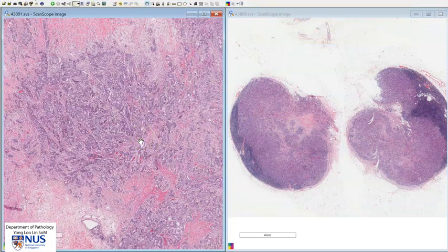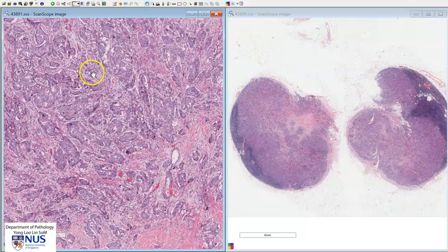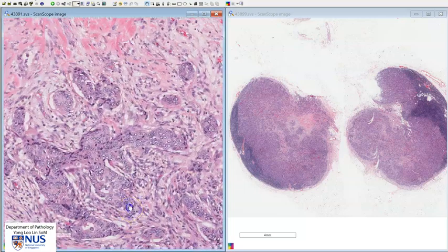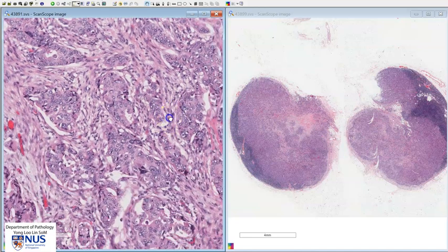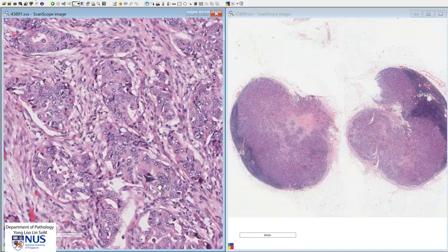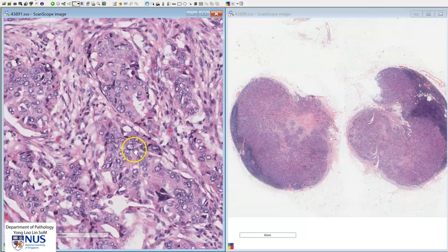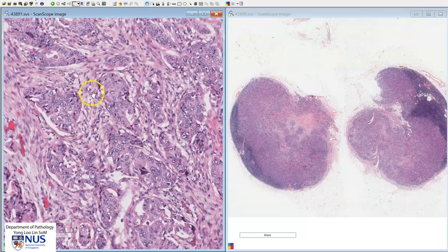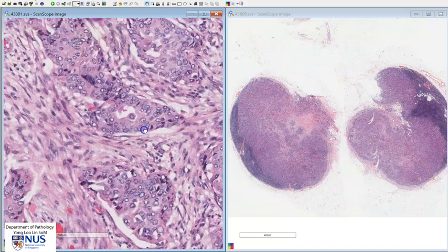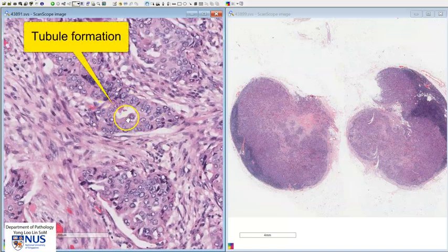Let's compare the primary and the metastatic tumors. In the primary tumor, we can see that the tumor is composed predominantly of solid rounded to irregular nests of malignant cells with a moderate degree of nuclear pleomorphism infiltrating into the stroma. There is focal tubule formation with a small lumen here.